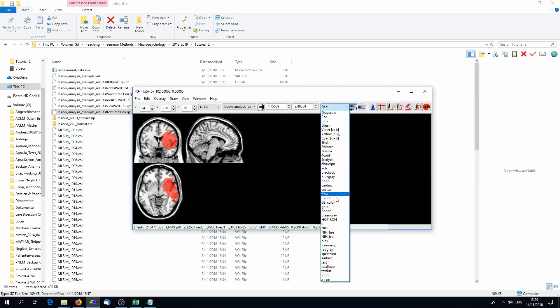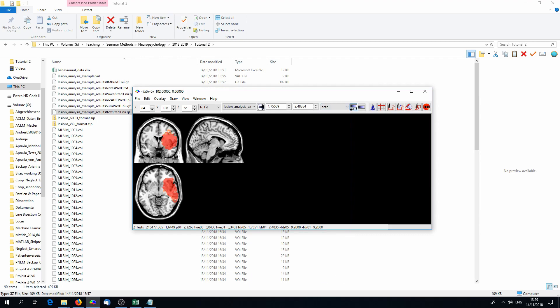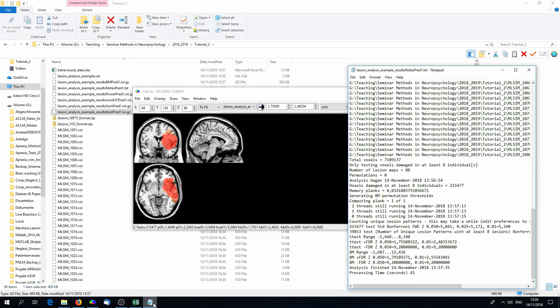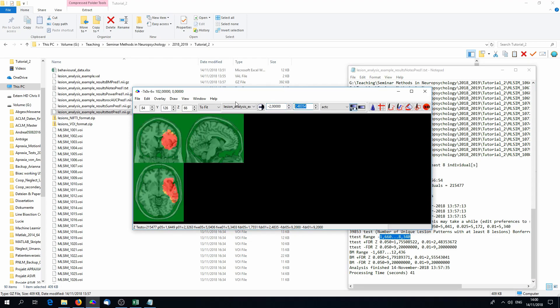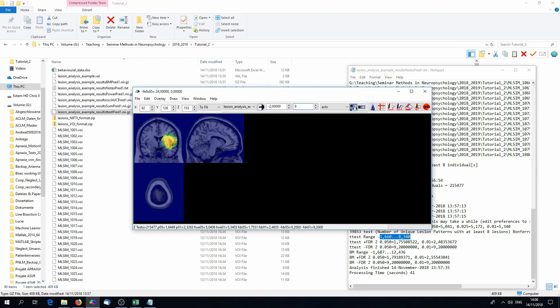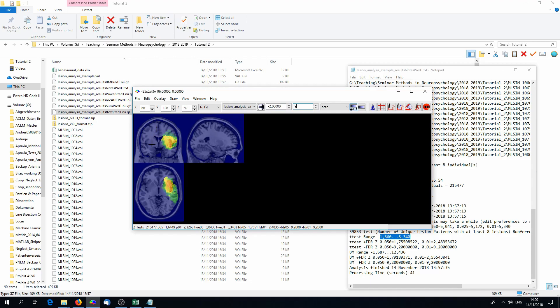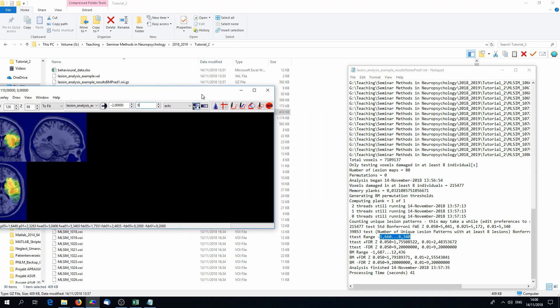We can change the color scaling, for example, to ACTC, to get some rainbow colorish color grading. And now we have to look in the text file. They will see that there was a certain range of t-statistic values, and there's a certain range of values shown in the image, and we can change it to show all voxels. You'll see that most voxels are bluish, and there are some areas where there are colors inside. These are the areas that have been included in analysis.